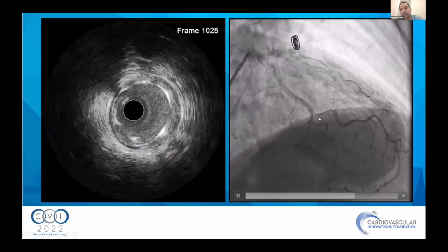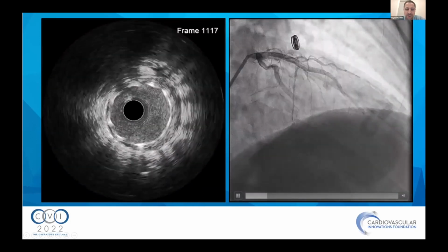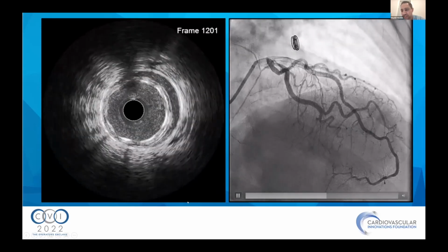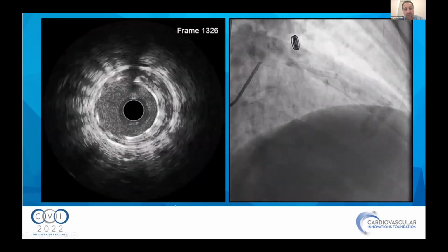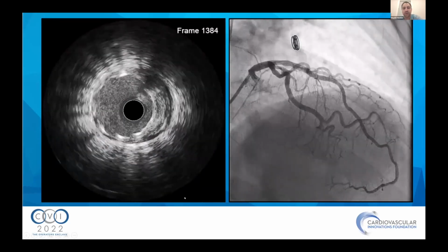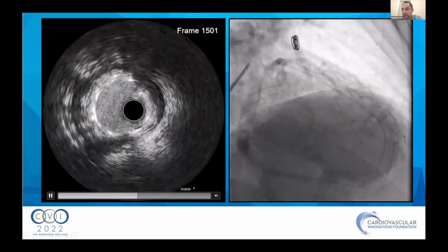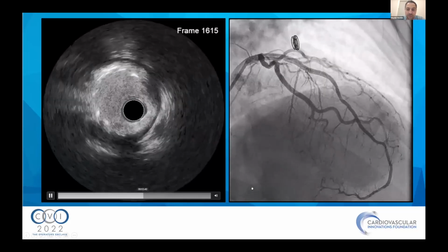I think imaging in cases like this is very important, especially with IVUS, because at least you understand if it's a no reflow or a mechanical issue, because the treatment is totally different. Instead of pushing adenosine and epinephrine trying to resolve no reflow, it's a dissection. You tuck the flap in and then you establish flow and you abort the story. It's nicely demonstrated. It's beautiful.